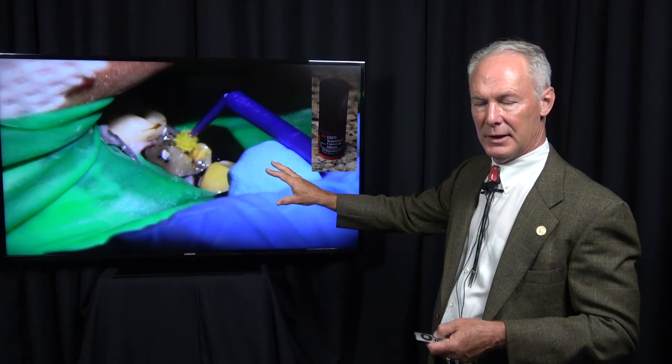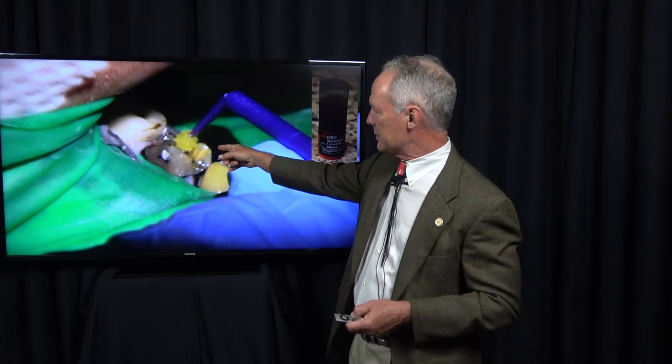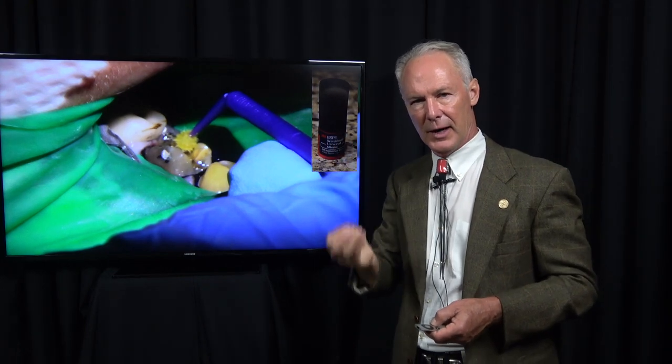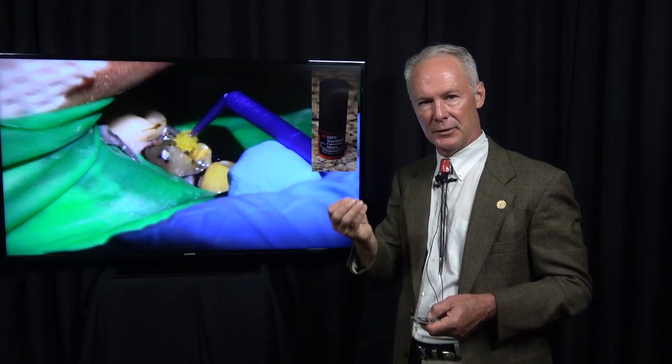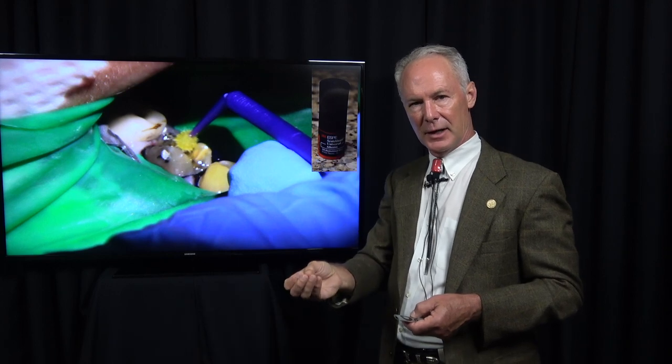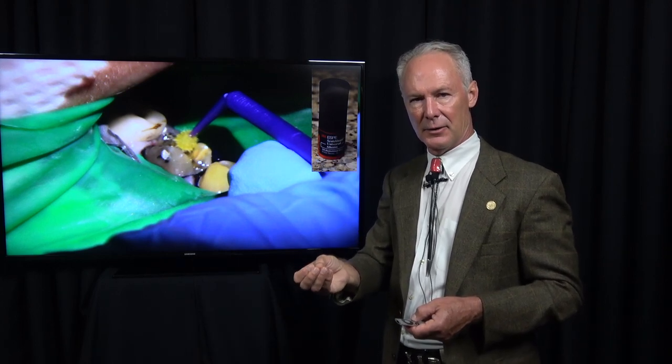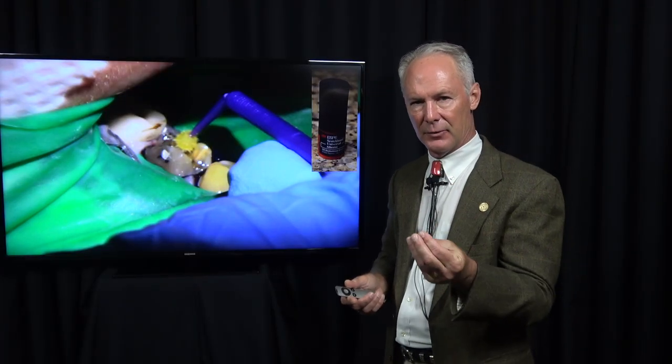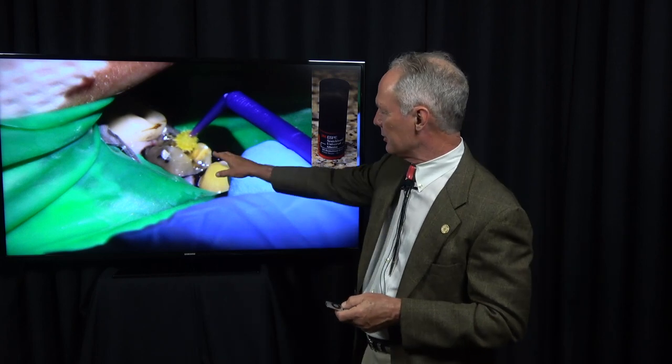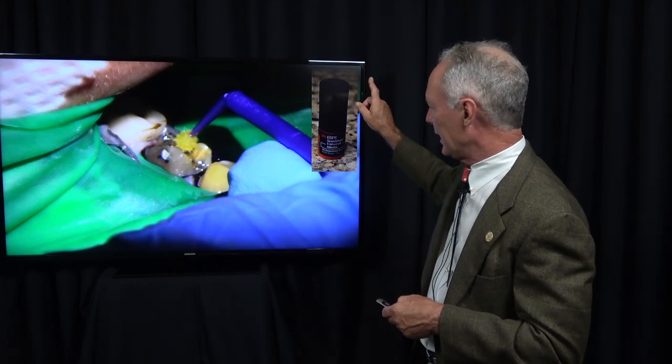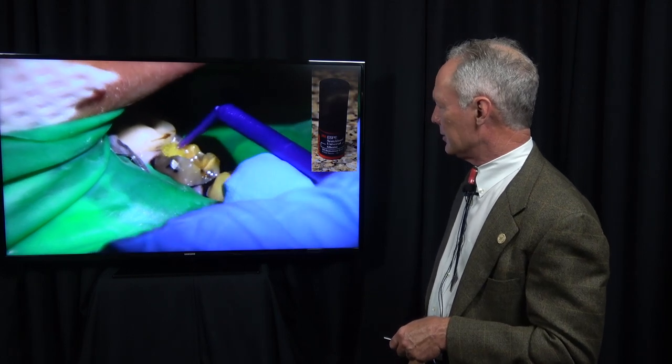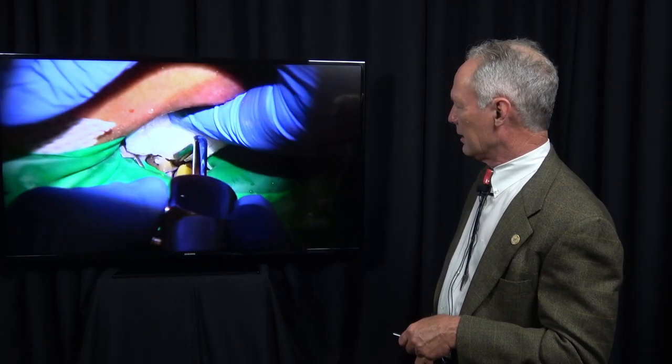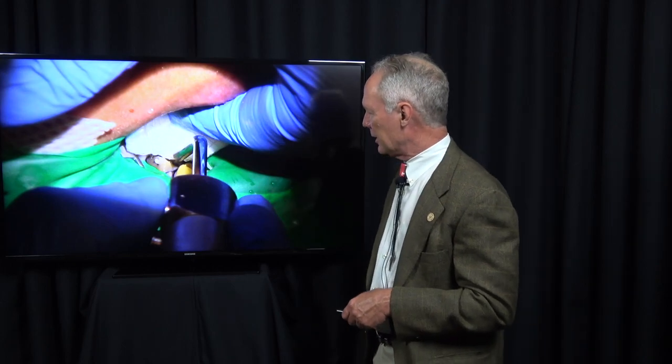Just leave it wet, not soppy wet, but leave it damp when you place the primer adhesive. Remember, the primer follows water. It's attracted to water, and it follows the carrier, which is acetone or alcohol, chases the water into the dentinal tubule. If you want that dense, hard, hybrid layer with your composites, be sure that you leave the teeth damp before placing the primer adhesive. Just sop that on, then place a two-by-two and blow it off with your air syringe.